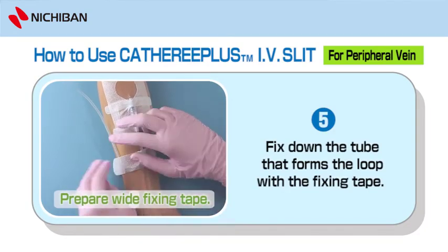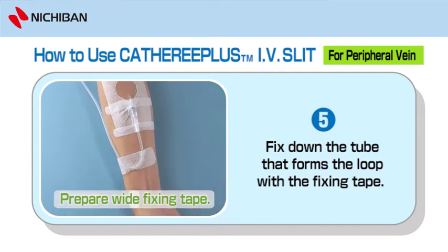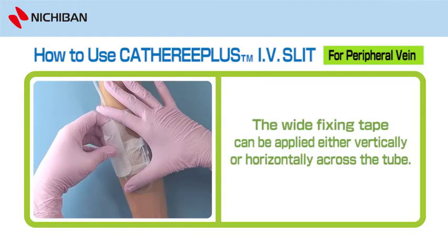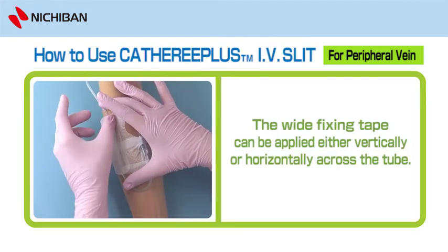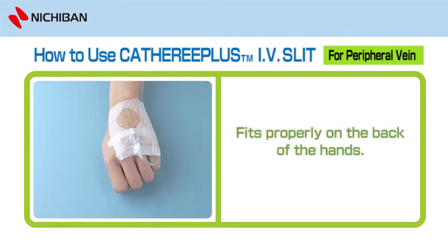Step 5: Prepare Wide Fixing Tape. Fix down the tube that forms the loop with the fixing tape. The wide fixing tape can be applied either vertically or horizontally across the tube. Fits properly on the back of the hands.